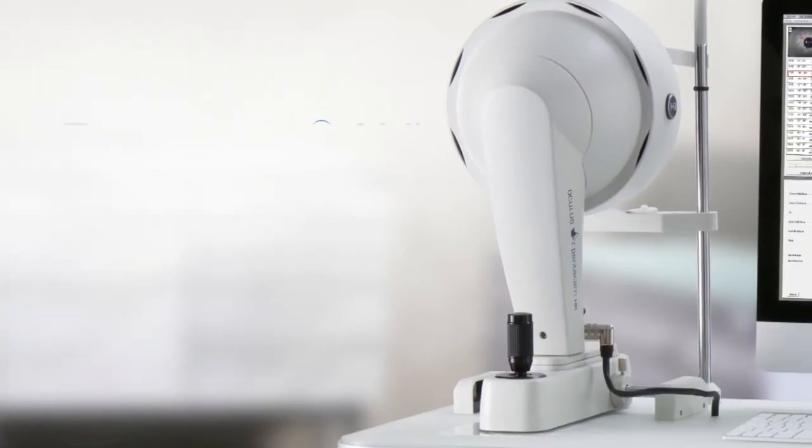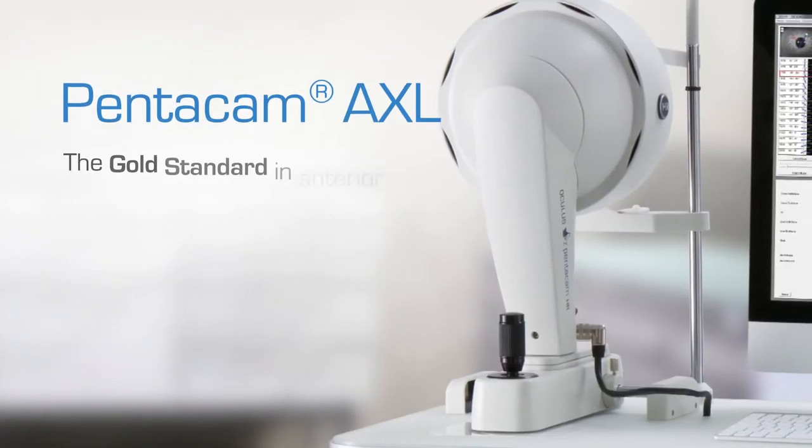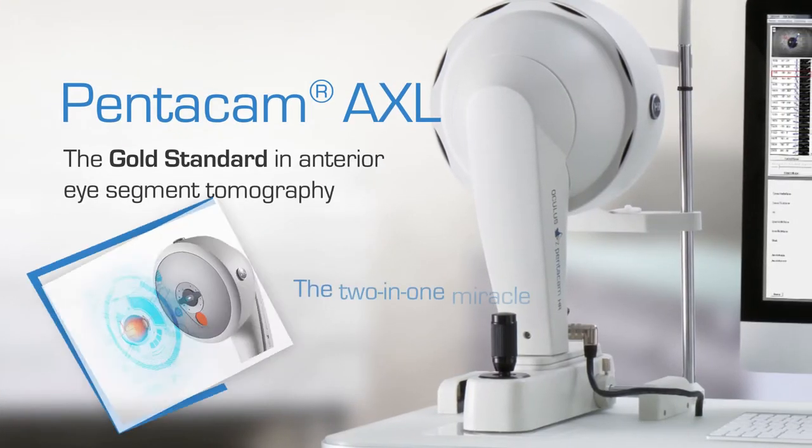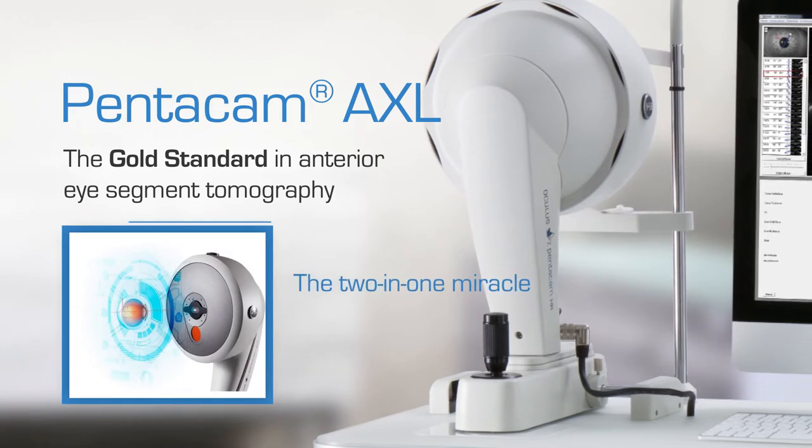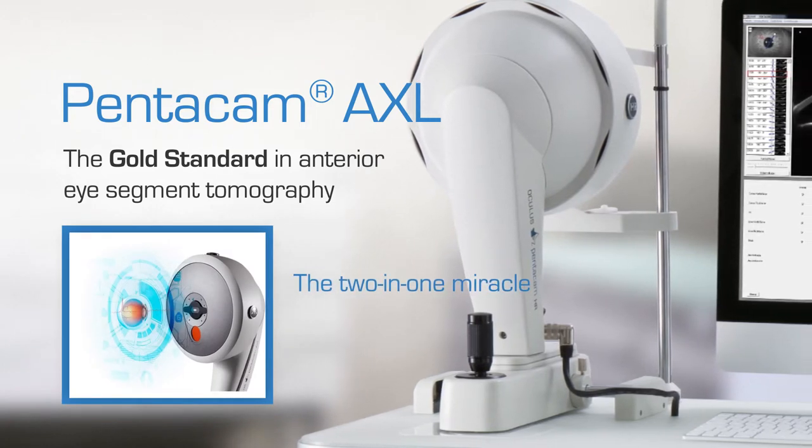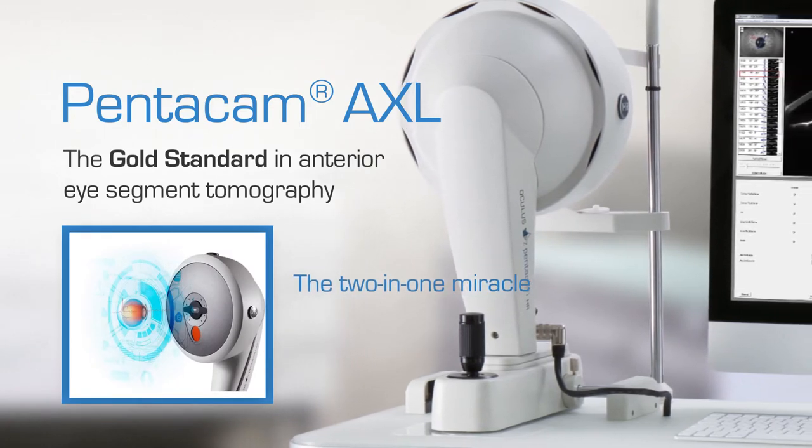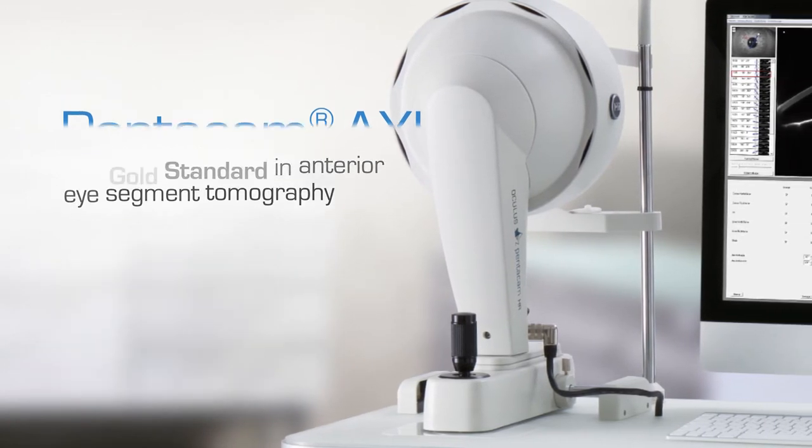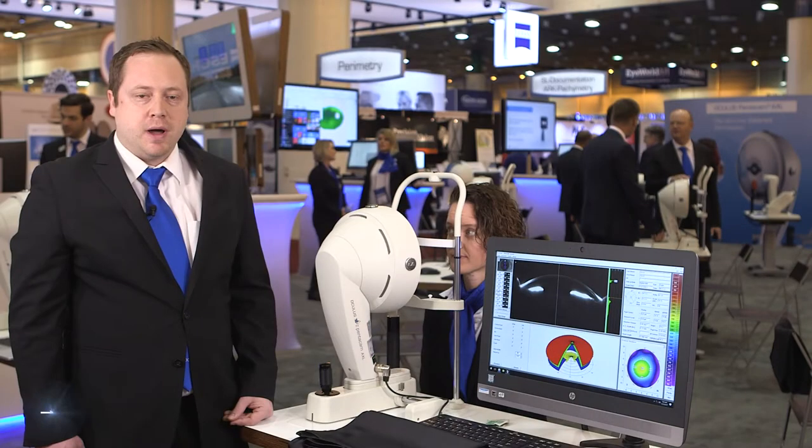Pentacam AXL is the newest model of Pentacam from Oculus and it's the only device in the US that combines Scheimpflug technology with optical biometry.